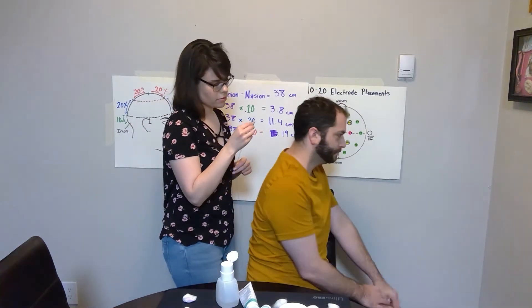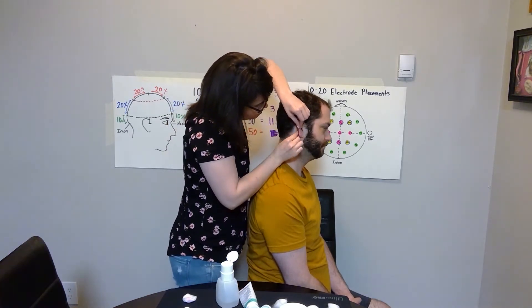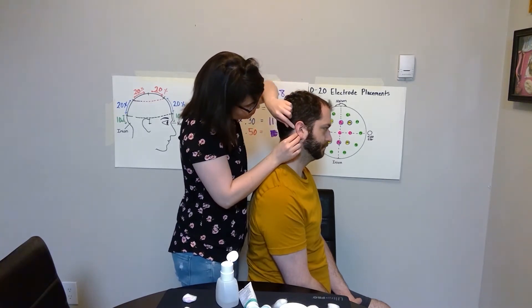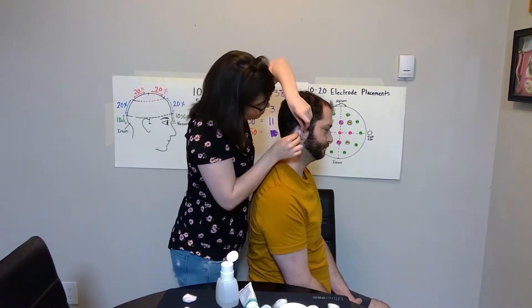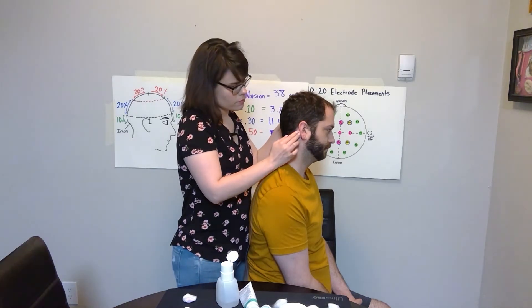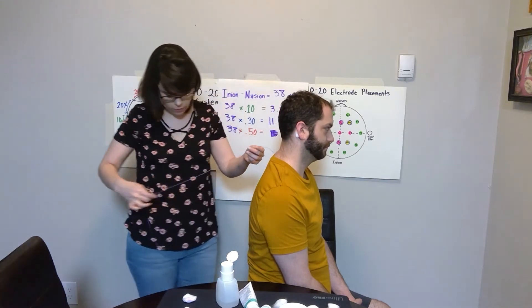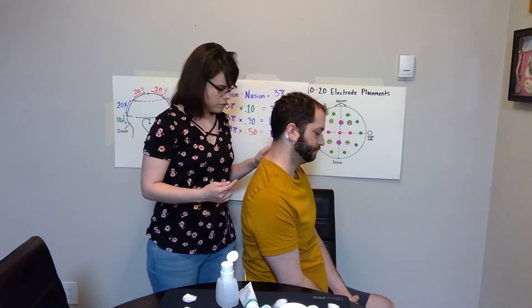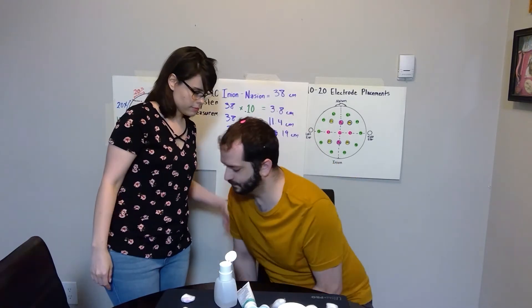Now we're going to place our electrode on the mastoid and press down firmly. I'm going to place a piece of cotton pad on top to make sure that it stays in place — just press firmly down so it stays. While you're doing this, make sure that your electrode wires are tangle-free and have them hanging behind your partner so they don't get tugged on.